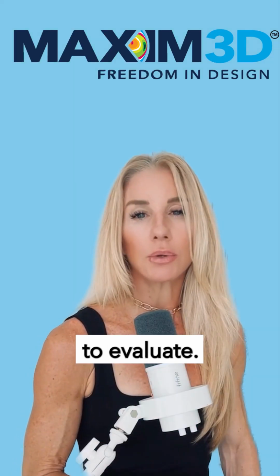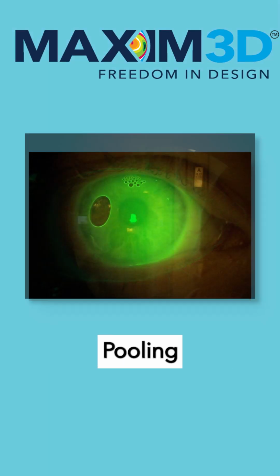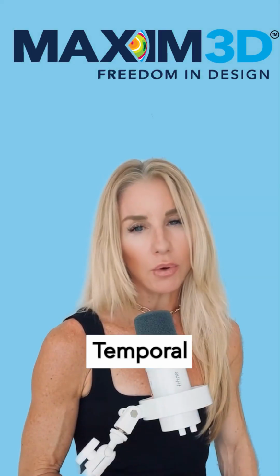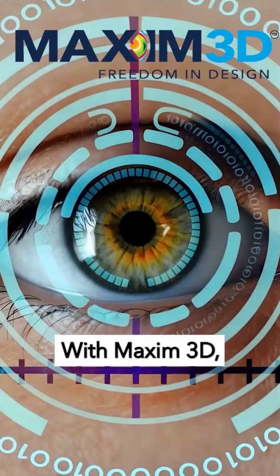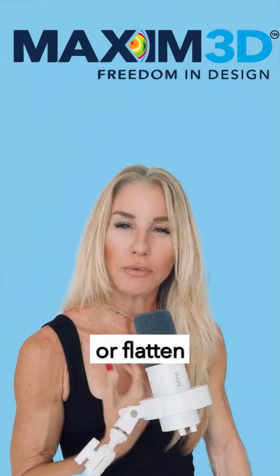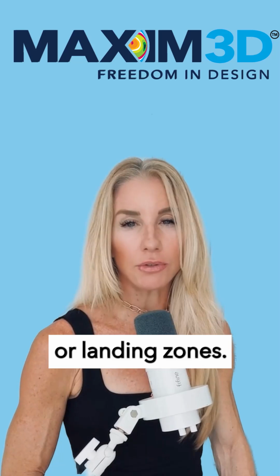Here is what to evaluate. Touch or bearing suggests insufficient vault. Pooling or bubbles suggest excessive sag or poor alignment. Temporal asymmetry may call for quadrant-specific or freeform limbal adjustments. With Maxim 3D, the limbal zone can be controlled independently, allowing you to steepen or flatten by quadrant without compromising the central or landing zones.